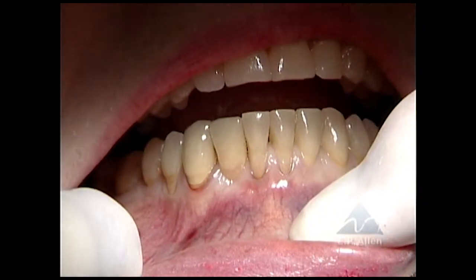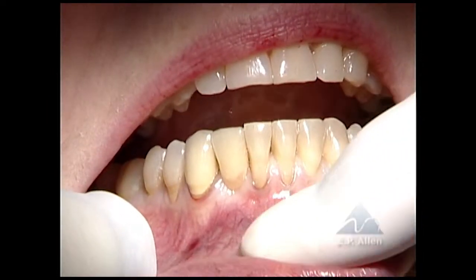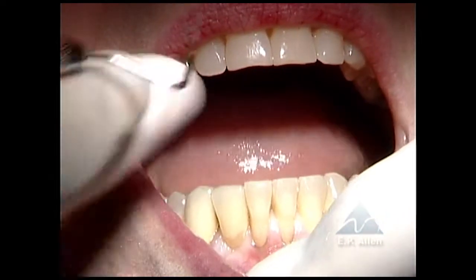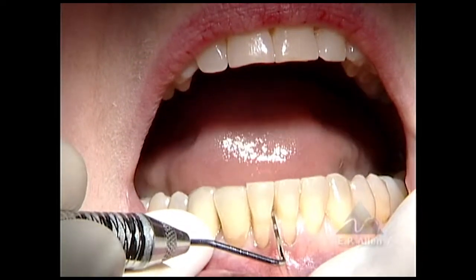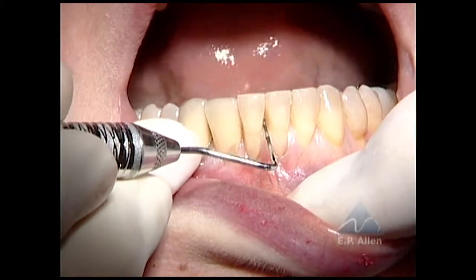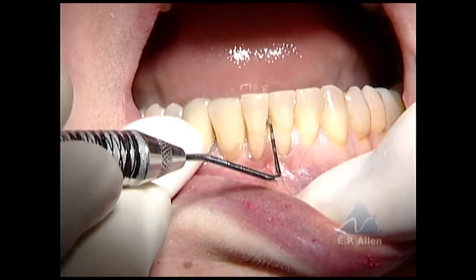We have the choice of two methods: the all tunnel or the alternating tunnel. And if we look at this with a probe and look at the interdental region, there's nice space here in the sense that there is integrity of the papilla from facial to lingual.